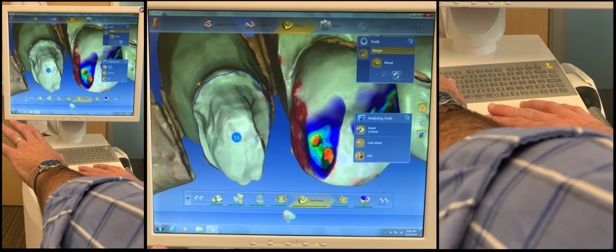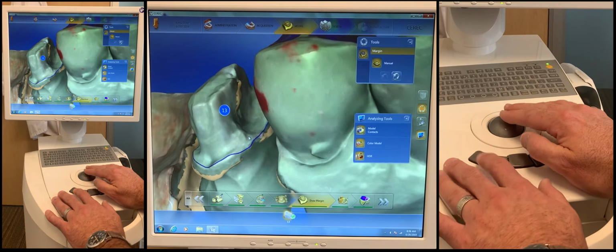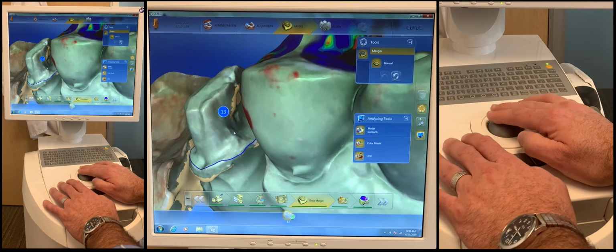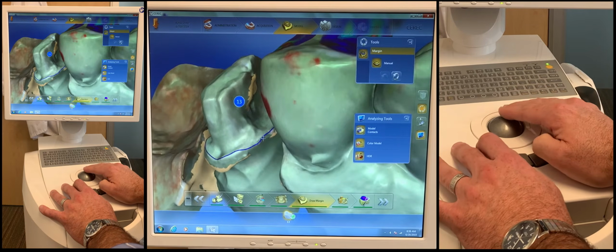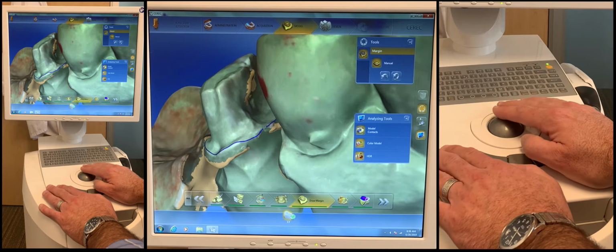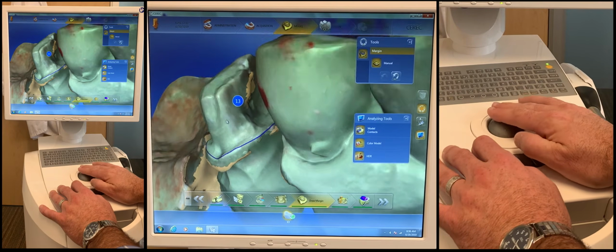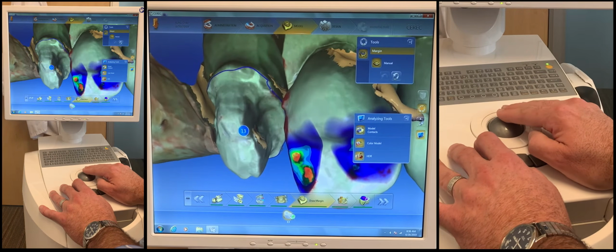So notice I double clicked at the end. Now I'm going to review, and yes, I don't like some of these spots. And yes, this is not the most clear margin. So we're going to go ahead and double click where I want to repair it. And double click to stop. Okay. Generally, I think that's okay. This is a little wonky.